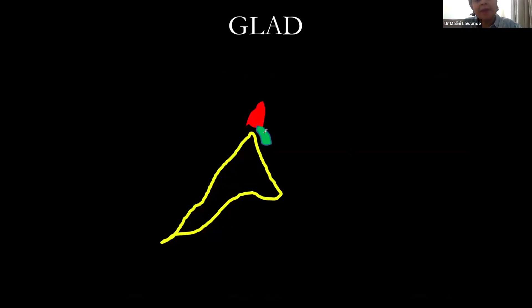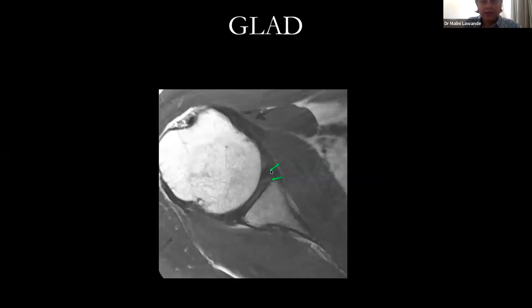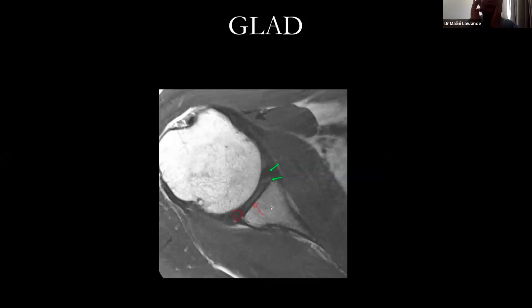When a labral tear is accompanied by an adjoining piece of hyaline articular cartilage, that is a GLAD lesion — glenoid labral articular defect. You can also simply describe it as an anterior inferior labral tear with a small adjoining cartilage defect. Hyaline cartilage appears intermediate signal intensity while fibrocartilage is dark, and the cartilage defect carries a slightly worse prognosis compared to other labral pathologies.